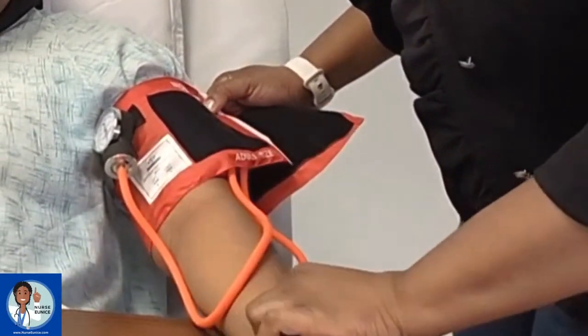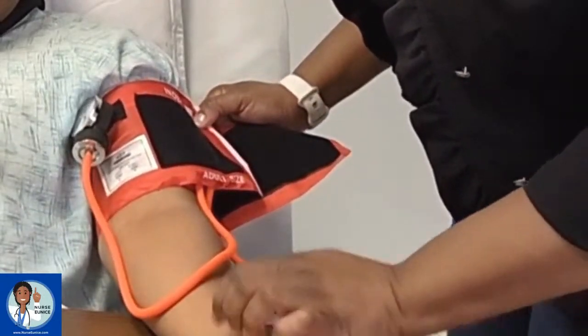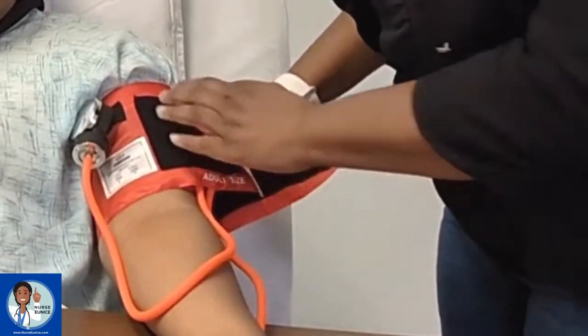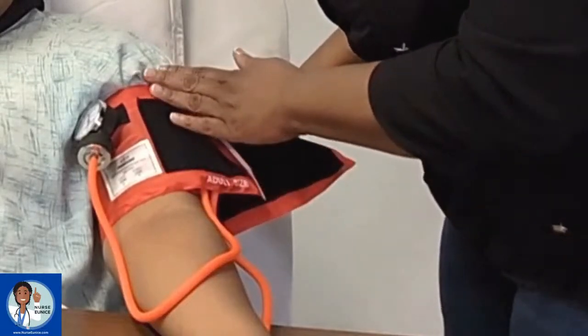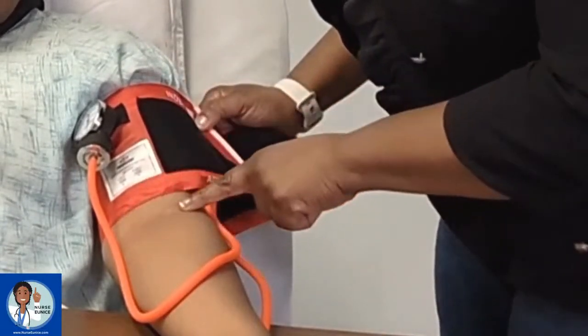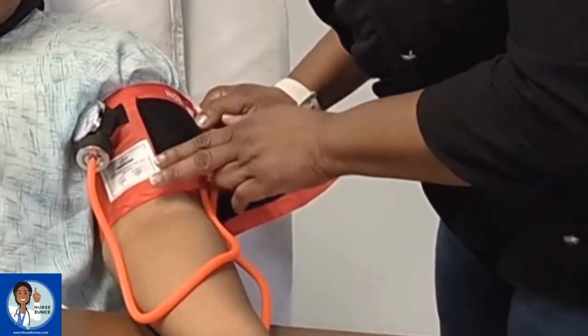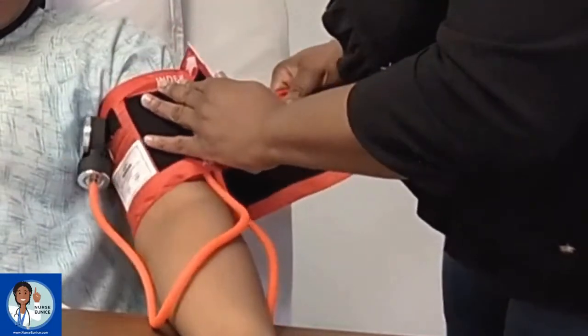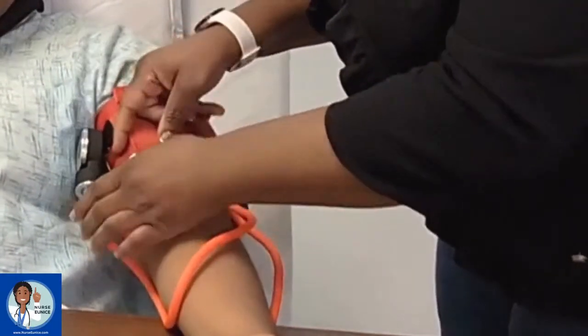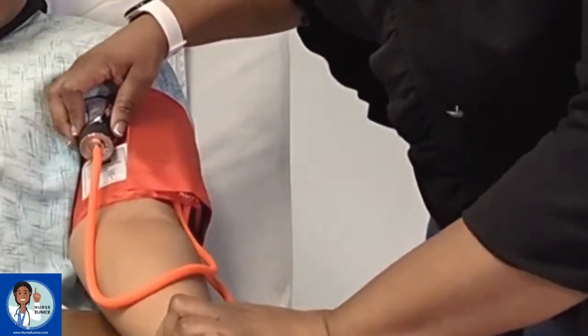Remember: if you can see it, it's not an artery — if you can see it, it's a vein. Whenever you're doing your cuff placement, you don't want the cuff too high or too low. This is the antecubital area. You want to make sure it's at least two finger breadths above the antecubital area so that you have enough room for your stethoscope. Then you're going to apply the cuff.